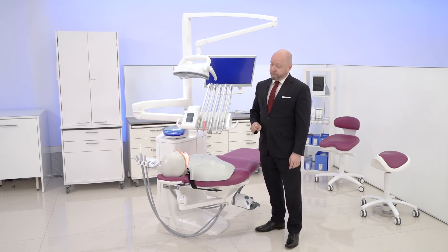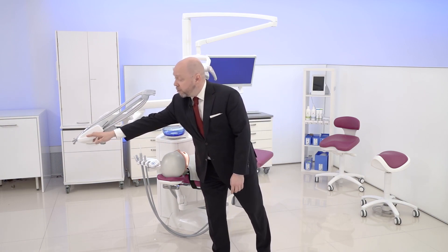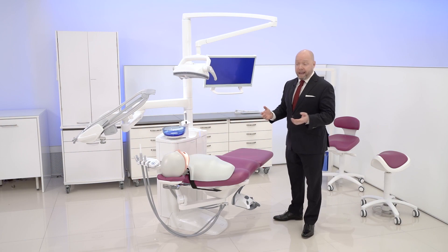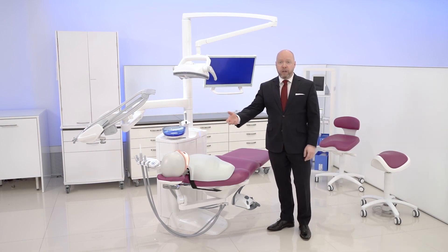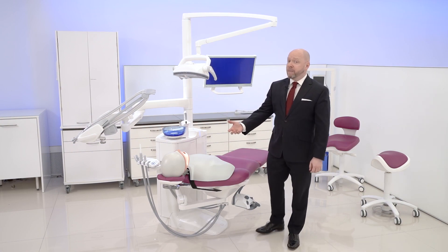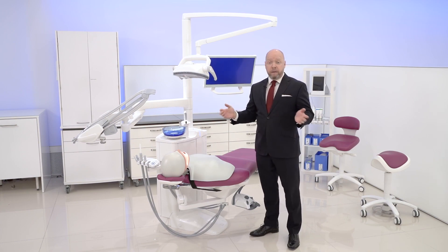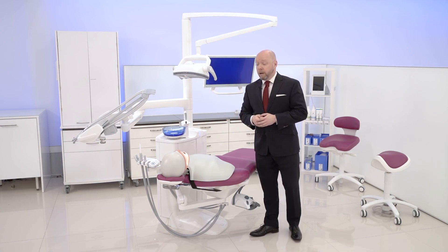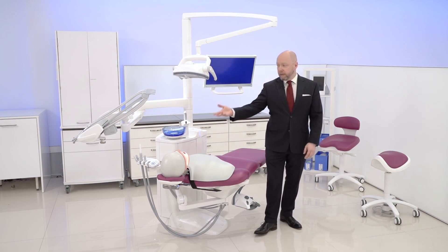The benefit of this setup is that before the patient enters, we can bring the instruments out of line of sight to create a more comfortable atmosphere. We have a very clean entry and exit for the chair, and after the care has been delivered, we can again take the instruments away. In a four-handed setup, the assistant can start preparing the instrument delivery for the next patient while the dentist sees this patient out of the chair and brings the next one in.